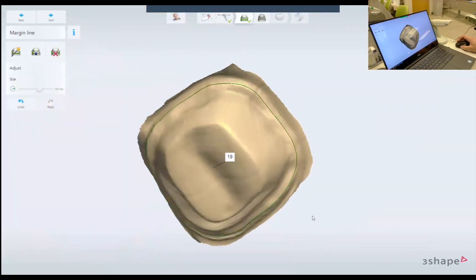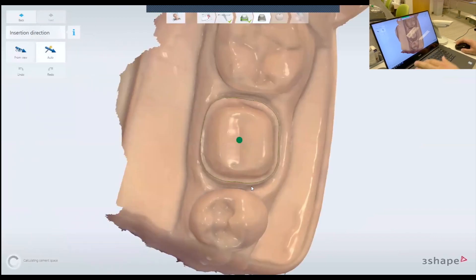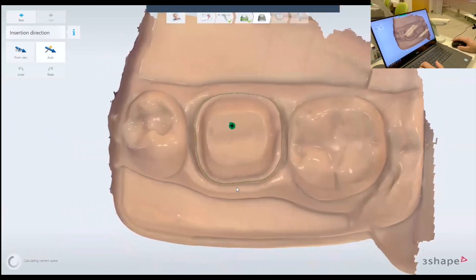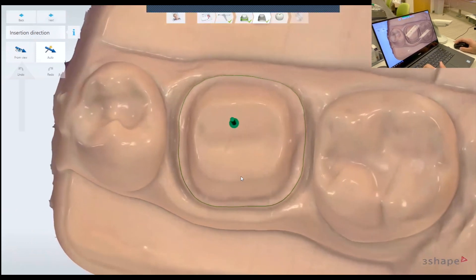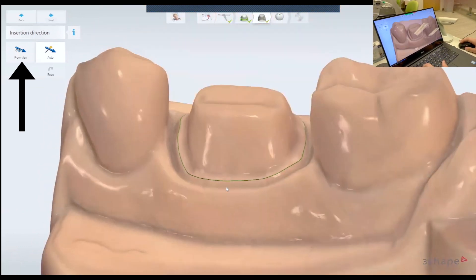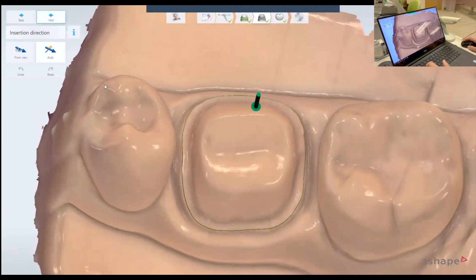Now I have my margin detected here, so I'm going to go next. The next stage is the insertion direction of the crown. Usually it's good at auto-detecting the insertion direction. If you want to change it, change it to where you think the insertion direction is correct and then click 'from view' here. But usually you don't need to do that — go next.